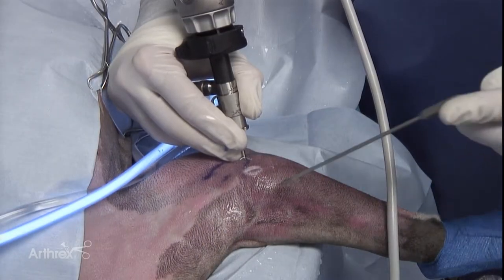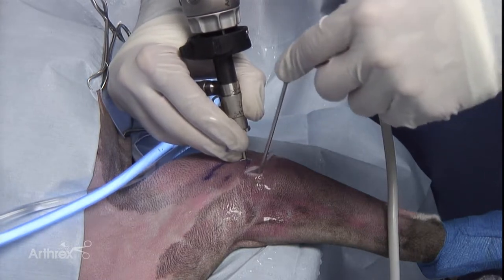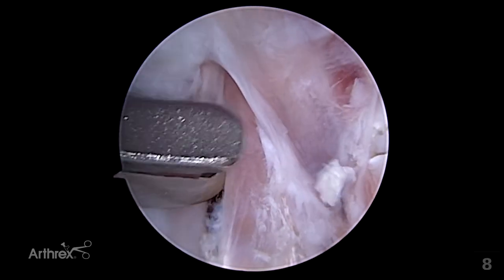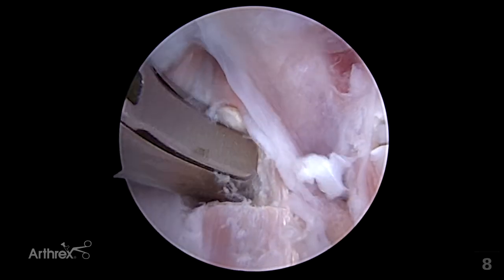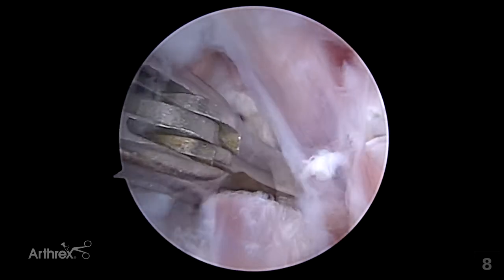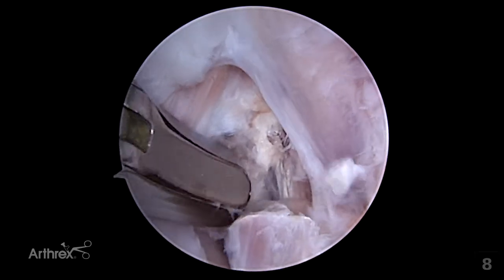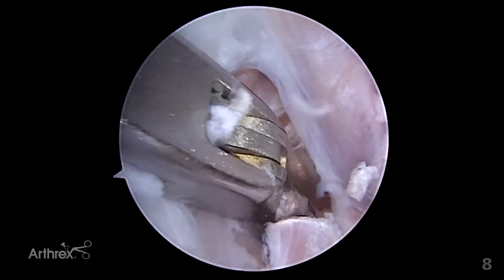Once the location is prepared, a standard punch can be placed into the joint. That punch is able to be positioned over top of the biceps tendon, and the biceps tendon can be progressively sectioned down along its length. It is important to carefully identify and follow the tendon to ensure complete release.